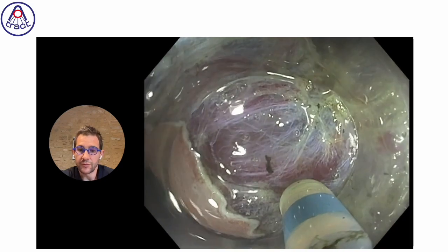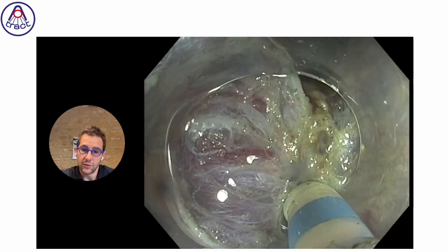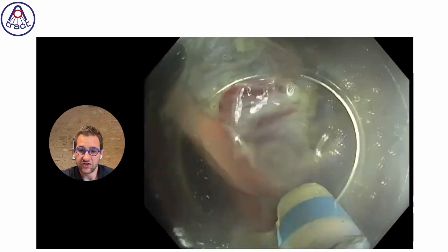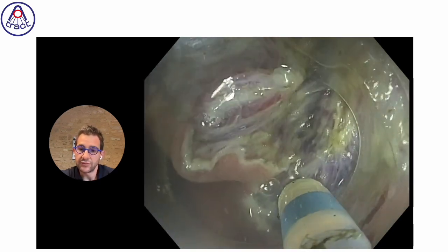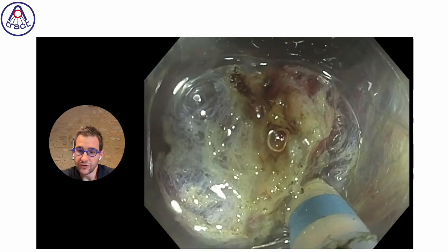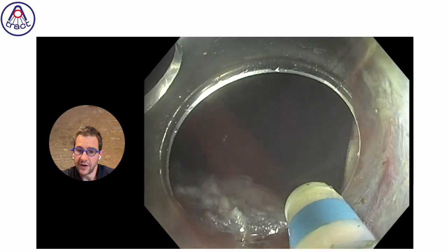And when you have a procedure that is going exactly like you want it to do, with the strategy you decided from the beginning, you save a lot of energy compared to adapting yourself to many unpredicted problems.